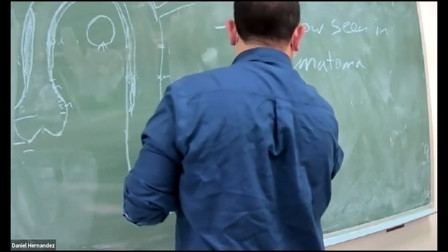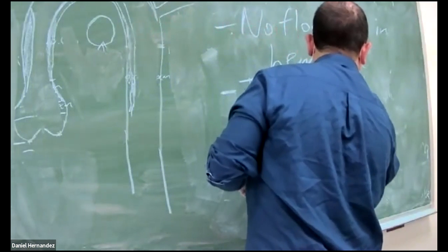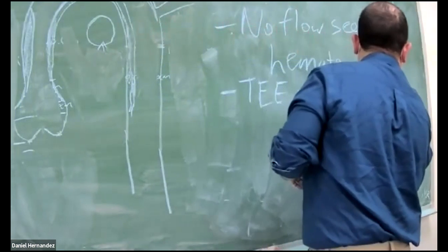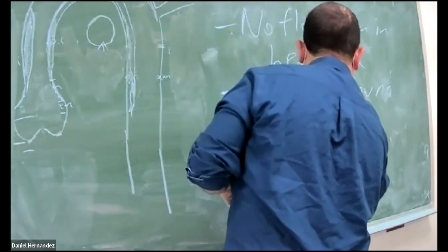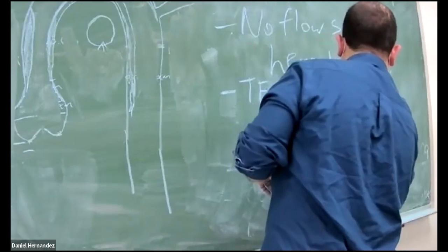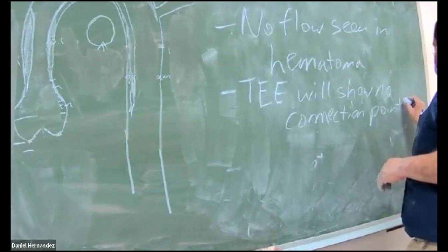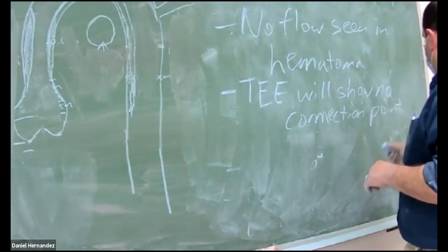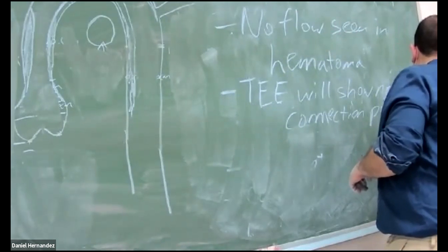TEE will show no connection point with the true lumen.